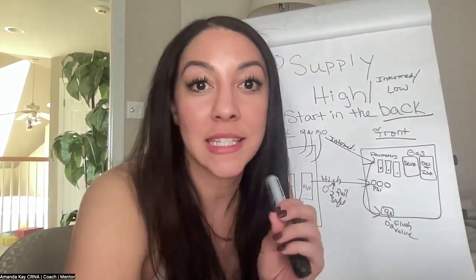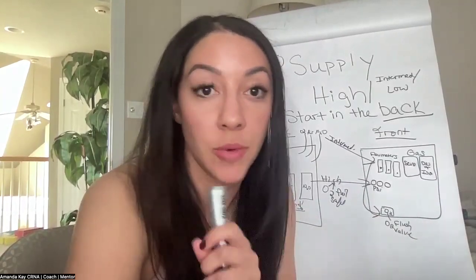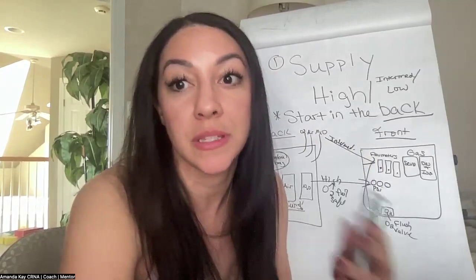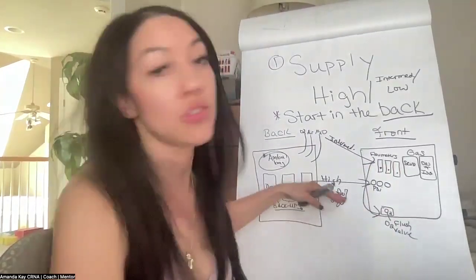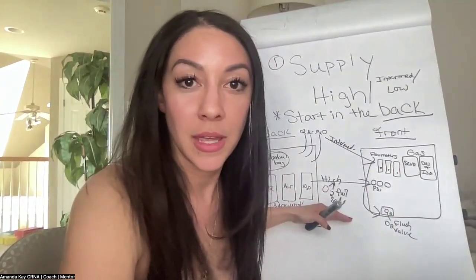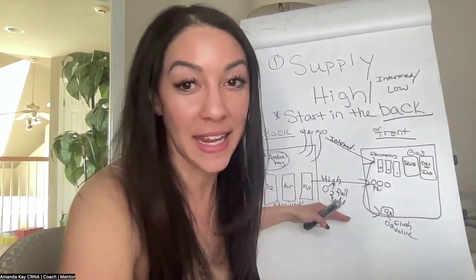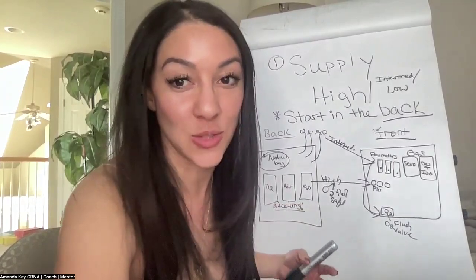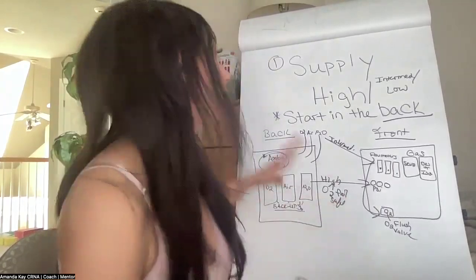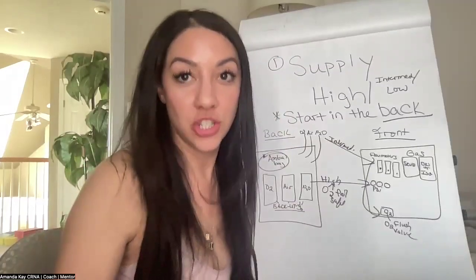And that's going to go off when there's less than 30 PSI of oxygen. It's usually just due to a depleted tank, especially if you're running a tank in an office or something like that. Or again, decreased pipeline pressure, something's disconnected. And it is also connected to your nitrous, because you never want to run nitrous oxide without oxygen, because you will fill them up with nothing but nitrous oxide. You will have no oxygen in the lungs and they will desat very quickly. It's really bad, so it'll automatically shut that off as well. And I'll talk about that more in a second.